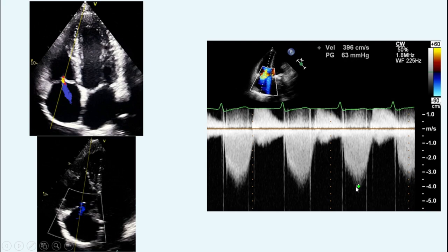For measuring, always find the border peak that has a clear border and is not a fading spot. The fading or blurring spot, we don't include it. We go to the spot that is very clear, sharp, and strong.